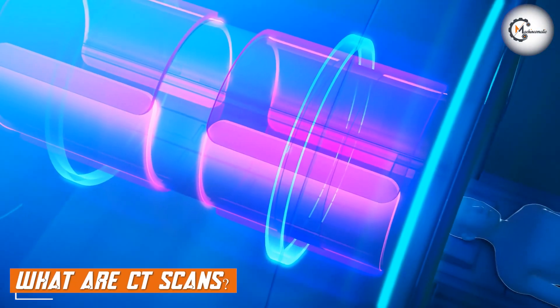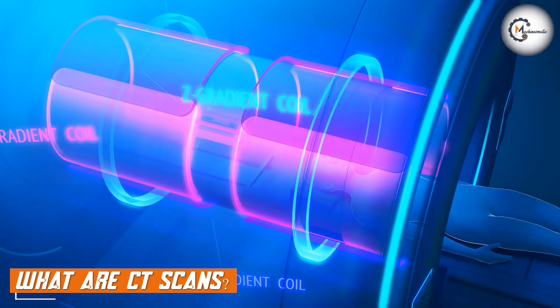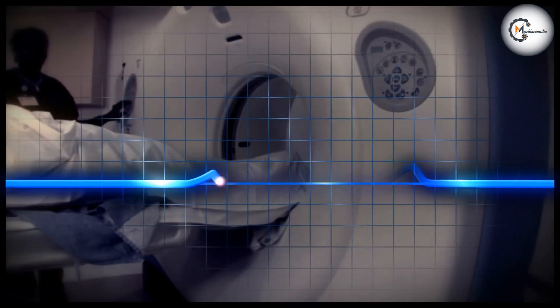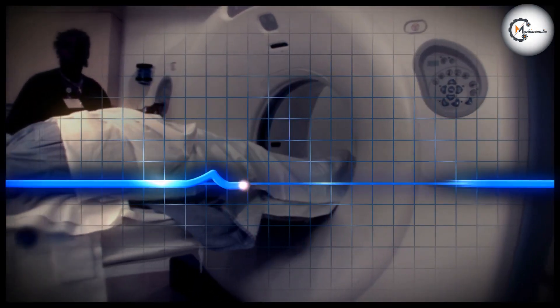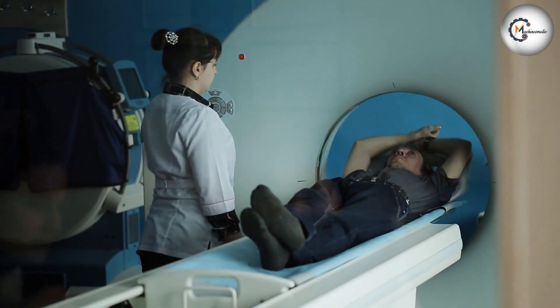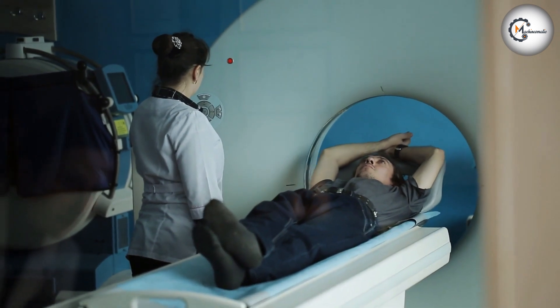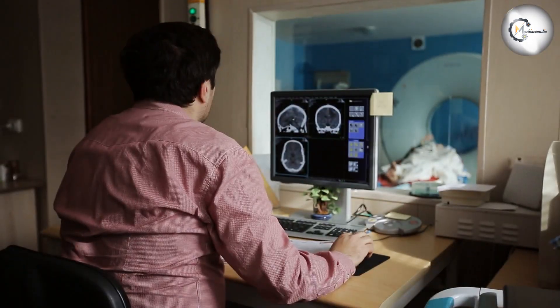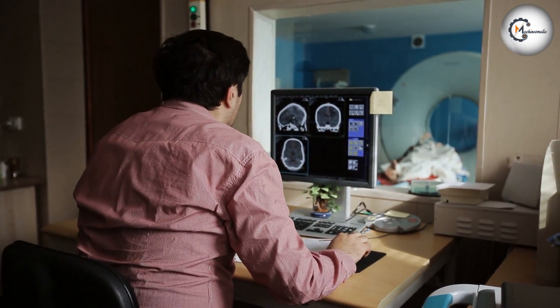Computed tomography scans are a type of medical imaging test that uses x-rays and advanced computer technology to create detailed images of the body. During a CT scan, the patient lies on a table that moves through a donut-shaped machine called a CT scanner. The scanner emits x-rays that pass through the body and are detected by a series of detectors, which send signals to a computer. The computer then creates images of the inside of the body based on the x-ray signals.